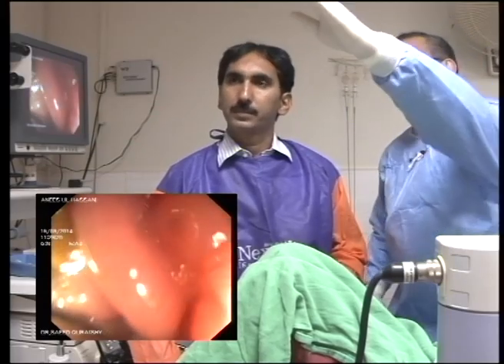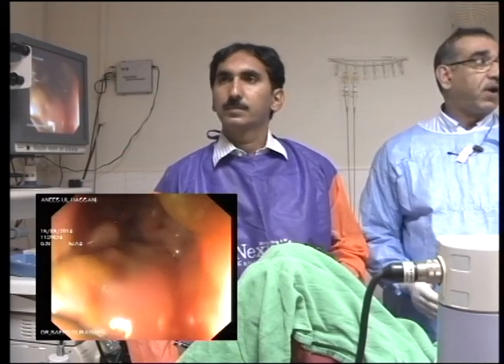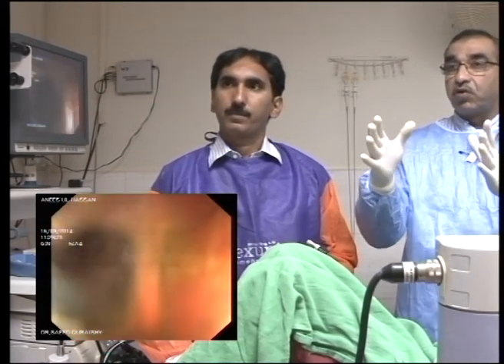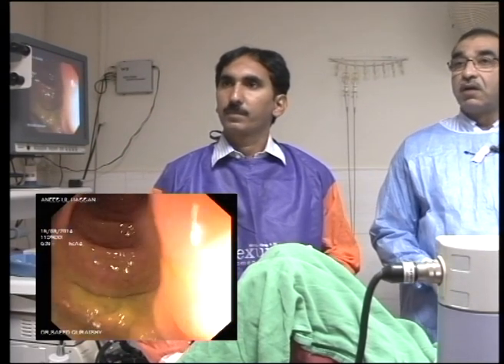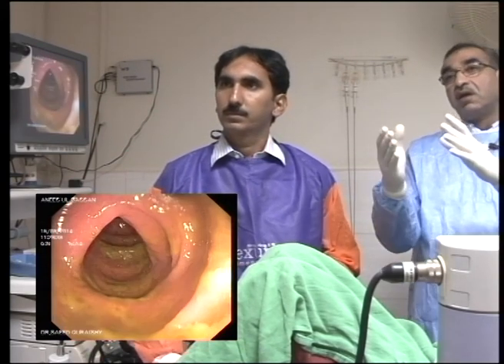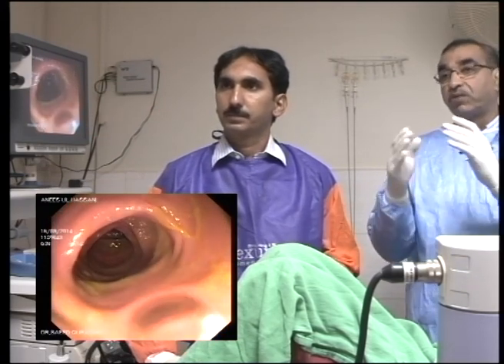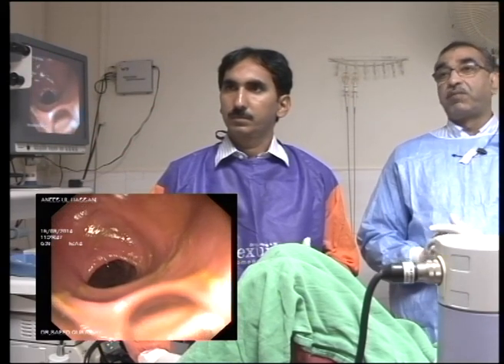Okay. So you are looking above it now. So that's the way to do it, so that you do not miss any part of the mucosa. Don't suction it because you don't want the mucosa to collapse. Leave it as it is. Take your fingers off the controls. Right, okay, that's good. Obviously, you can't do it perfectly now, it's your first time, but this is something you have to do as homework. Work on the technique when you are practicing in your hospital.